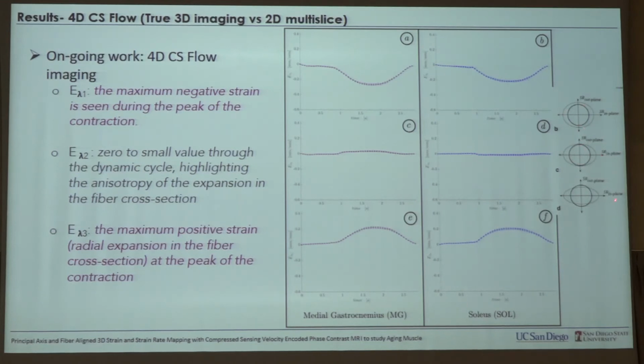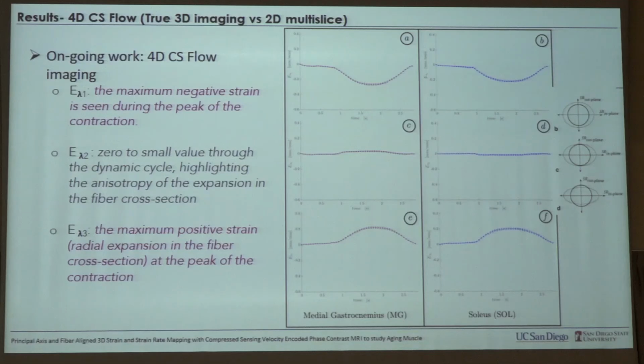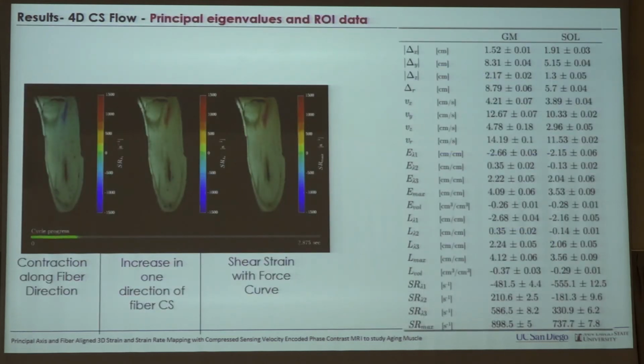So we have these three different possibilities in which both the through plane and the in plane direction increase, as you can see this outer layer, or one increases, the other decreases. And in the third case would be one side remains constant, the other increases. And this is what essentially is indicated by a combination of these two figures. And what that indicates basically is the presence of something like costameres which restrict that motion.